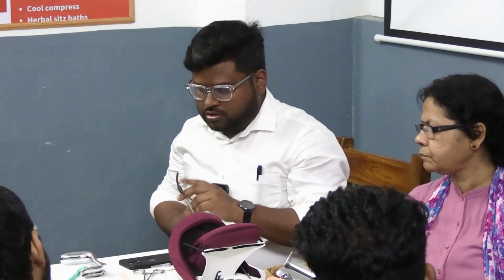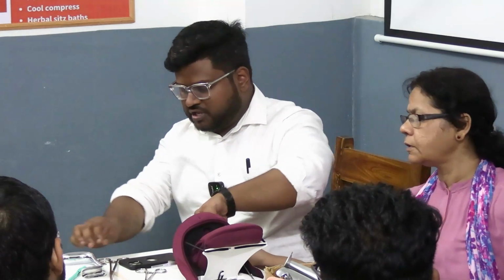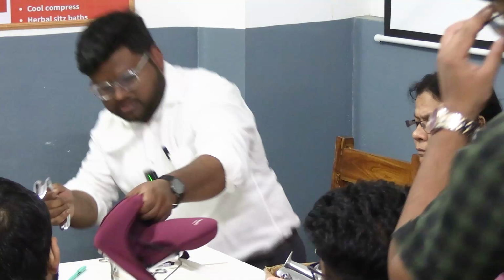Everybody has seen a copper T, right? A horizontal limb and a vertical limb, with two long threads hanging from the vertical limb. Imagine this is a Kelly's forceps, which is a bit bigger, with an anterior curve. We hold the vertical limb with the Kelly's forceps. How do you insert? Firstly, you use your sponge holding forceps.